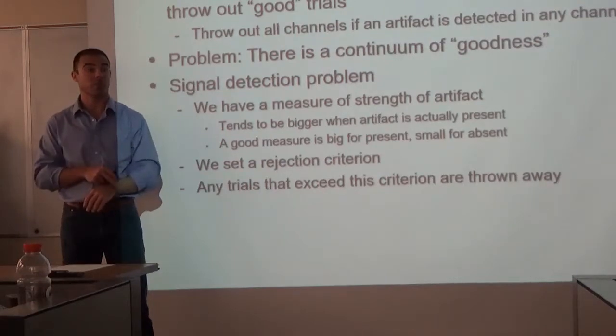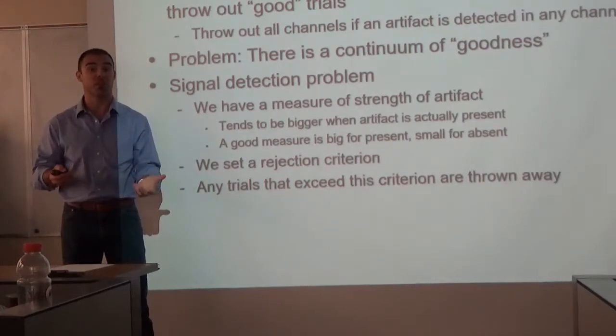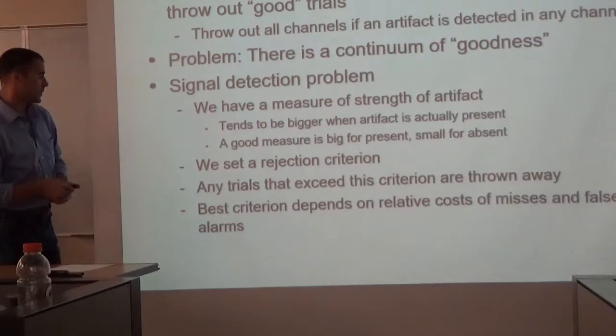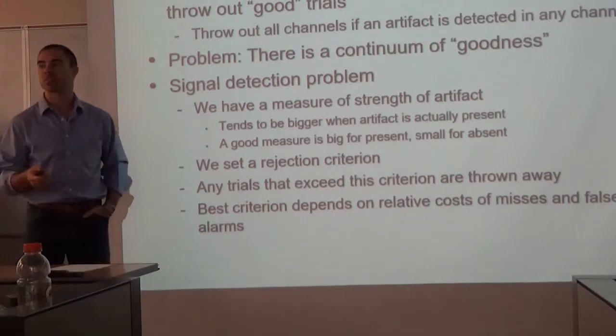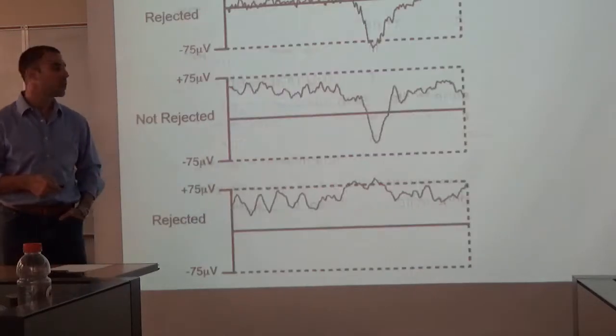And you guys will get to reject a lot of data and figure out where you think is good data and what's bad, okay? And again, we talked about misses and false alarms last class, and so the best criterion is going to depend on that relative balance between misses and false alarms that we talked about earlier.